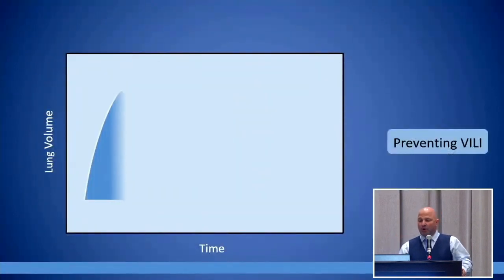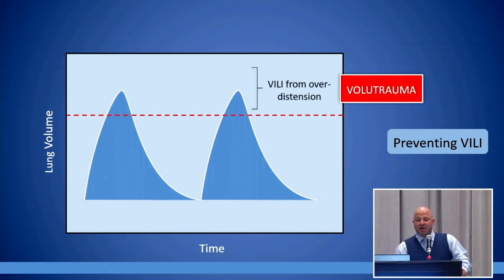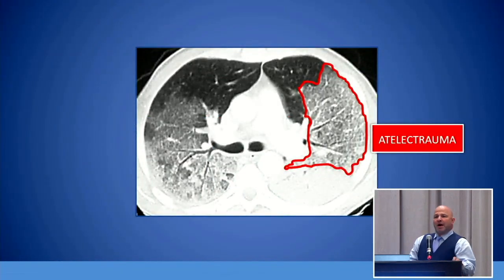And so as you roll this forward and you think about lung volume itself and lung volume on the vertical axis there, we can clearly put too much in, and that is what we would call volume trauma in terms of overdistension. And the other idea here is that you can also put too little in terms of lung volume. I'm not talking about tidal volume, I'm just talking about the lung volume itself. Previous speaker talked about using pressure to just keep the lung recruited, and that holds true in this aspect.